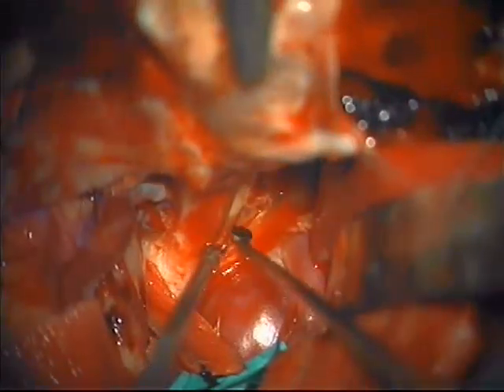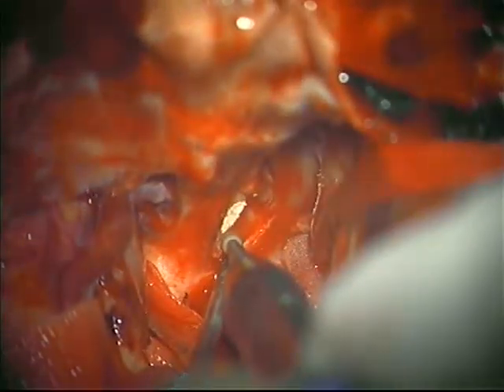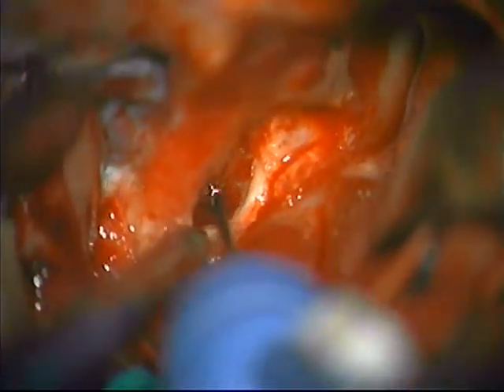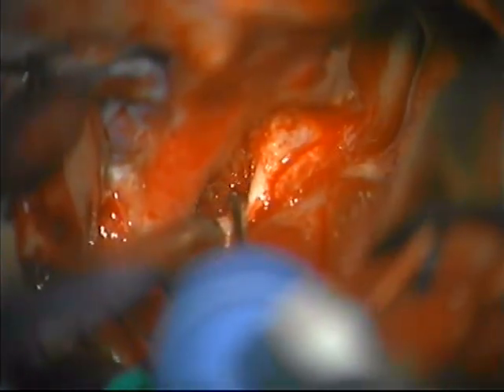Using a high-speed diamond tip drill, the tip of the anterior clinoid process is resected. We get the tip of the clinoid process in one piece, and we inject fibrin glue at the roof of the cavernous sinus to avoid bleeding coming from it.